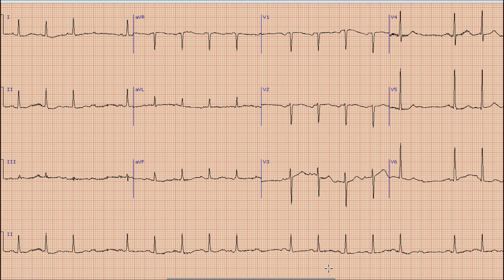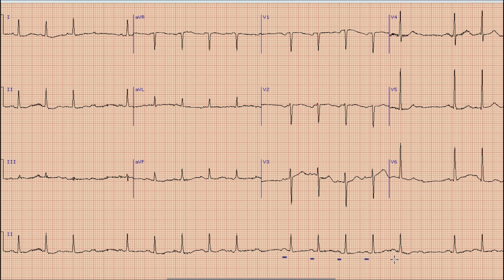Next we have to differentiate between Mobitz II AV block and non-conducted PACs. For that we follow the P waves. Starting here, we can see a P wave here, another P wave here, another P wave, another conducted P wave, another one, and another one being conducted. By looking at the pattern and rate of P waves, we can say there is another P wave here in between these two conducted P waves.